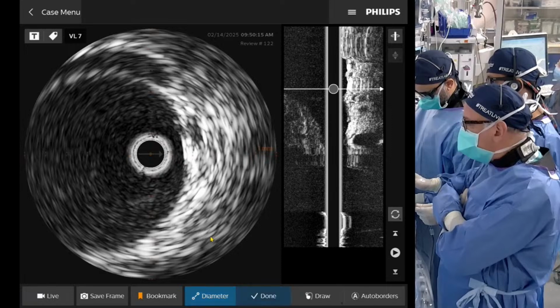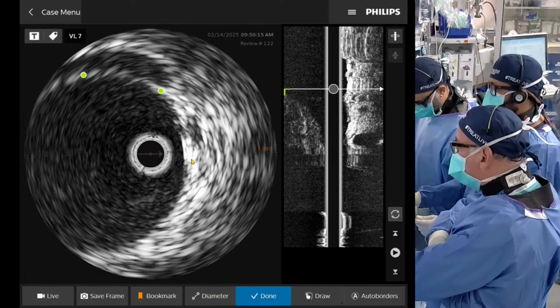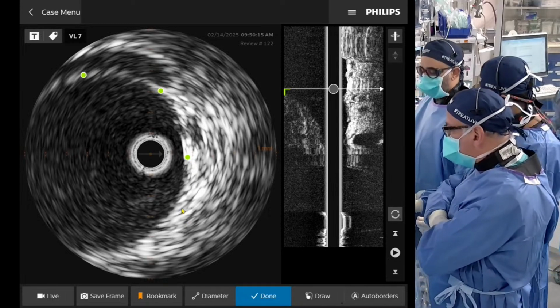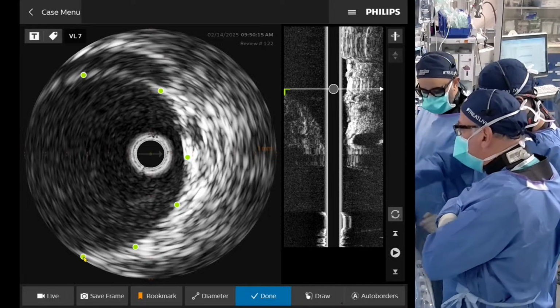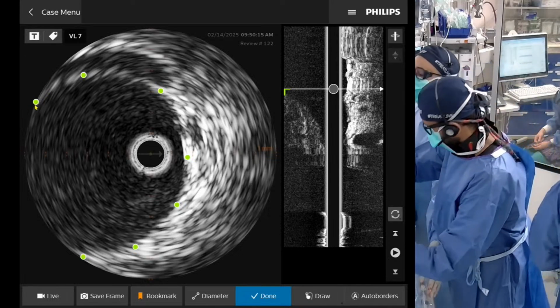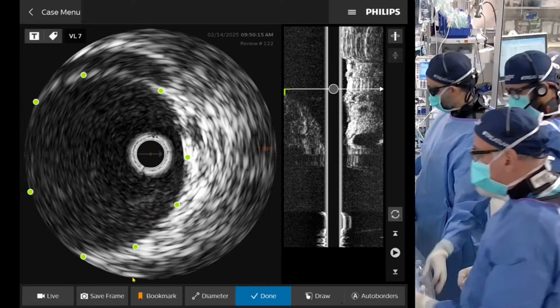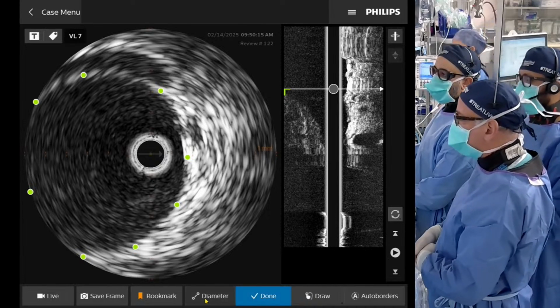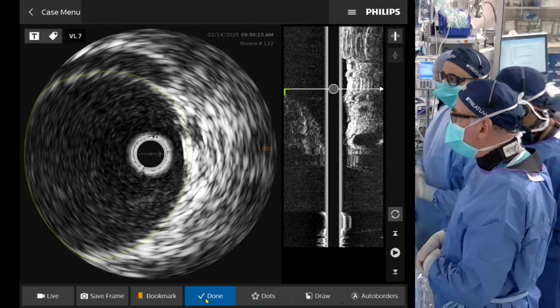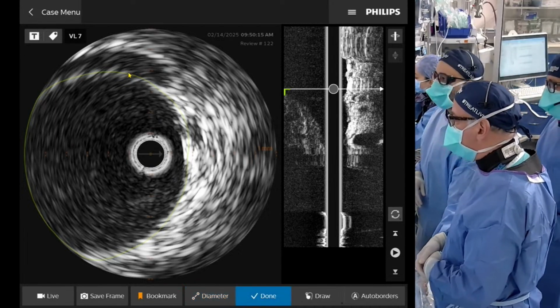Does this stent go above 7, Rob? Do you know? So this stent is not commercialized for larger than a 7 millimeter diameter. But as I think you're all aware, because it's a balloon expandable stent on a semi-compliant balloon, if you take it to 17 atmospheres, it will enlarge to approximately 7.5 millimeters.